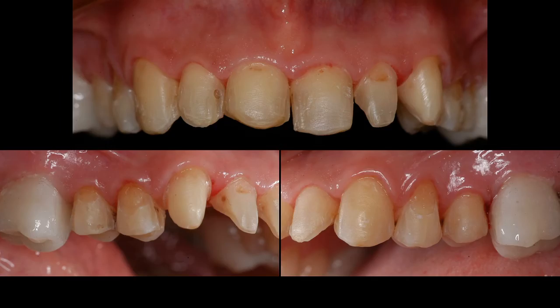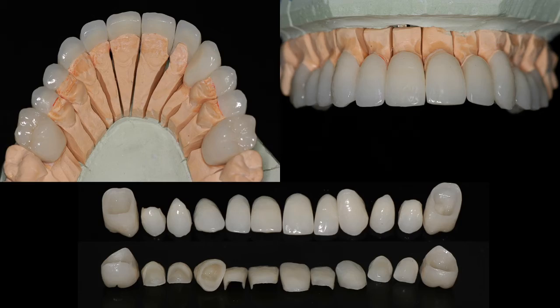Once we agreed upon the treatment, the preparation for this patient was to remove all interferences, decays, composites, because we'd like to set our margins on pure enamel and not on composite or decayed restorations. For that, it was prepared. And these were, as you can see, the preparations. We have six anterior veneers and some partial veneers on the premolars, and the canine was full coverage, as you can see.